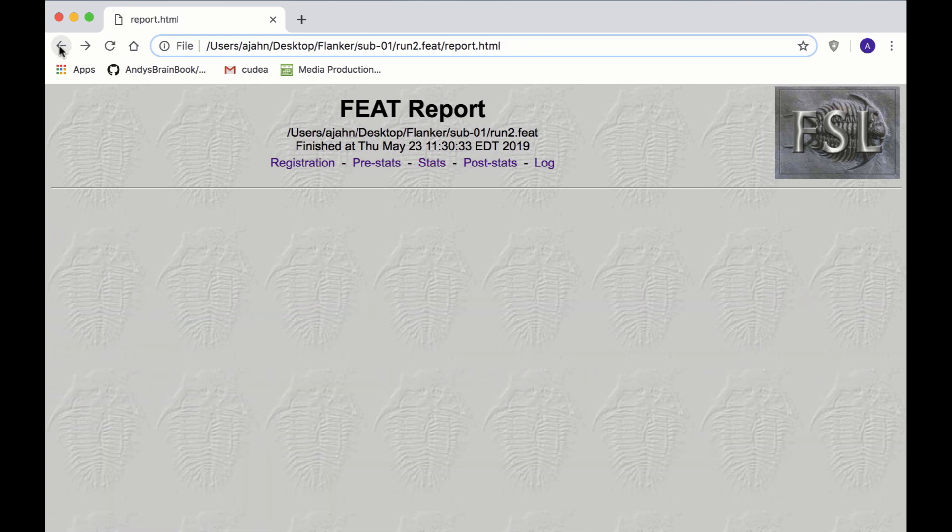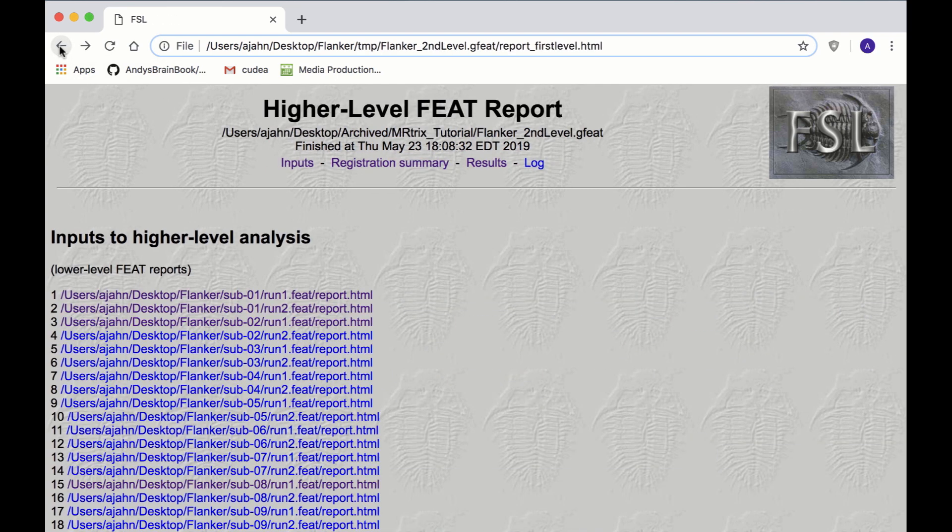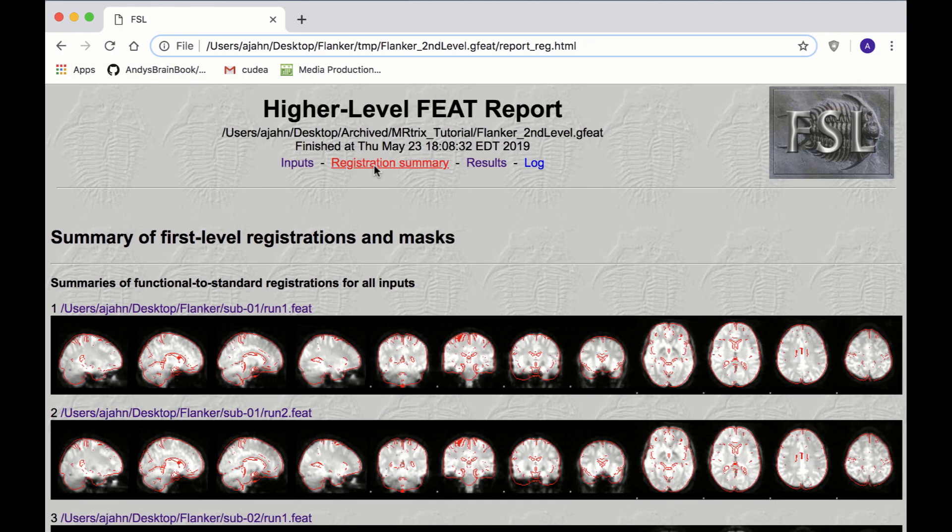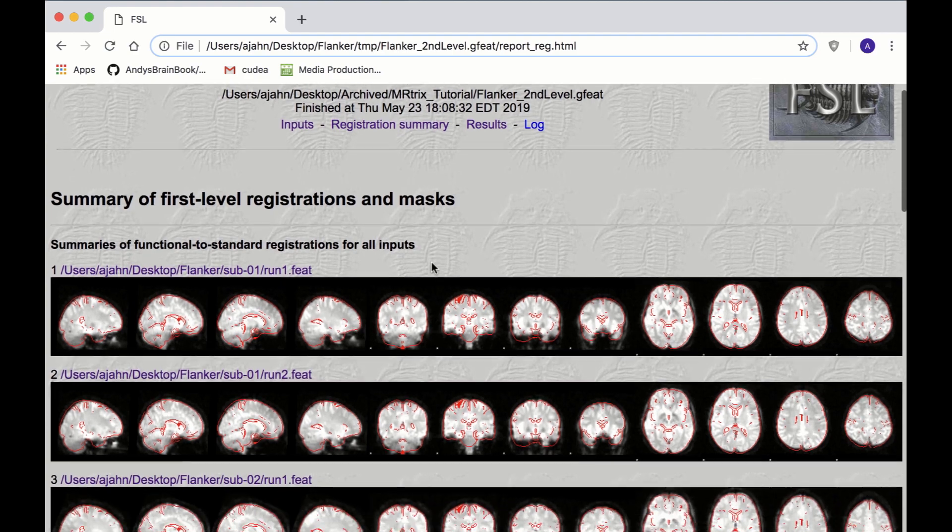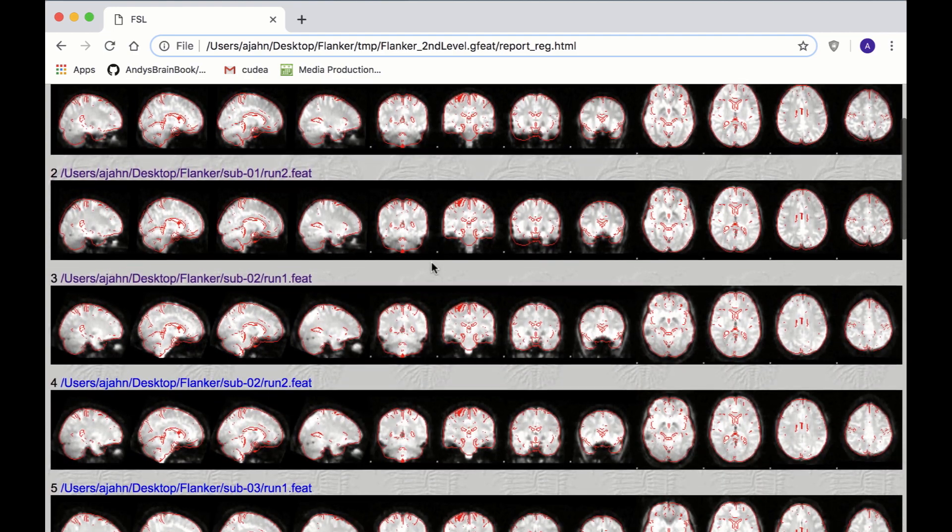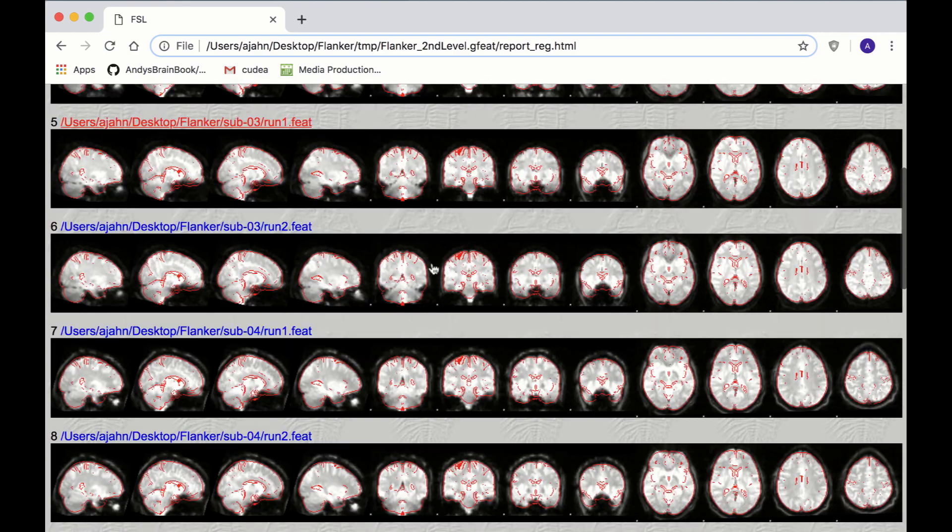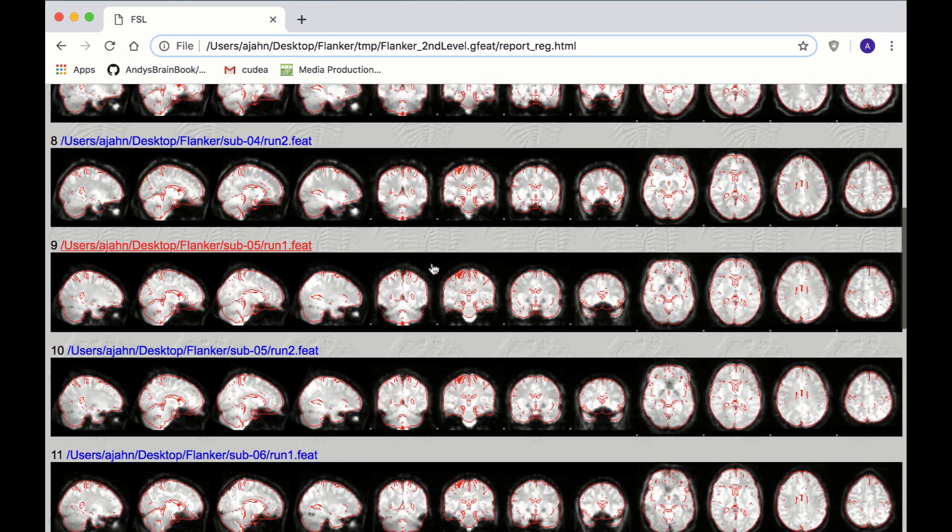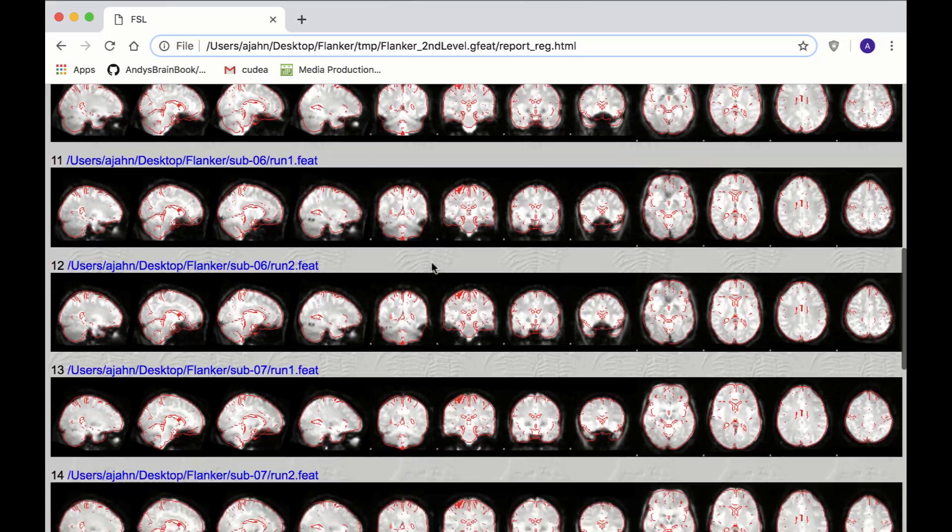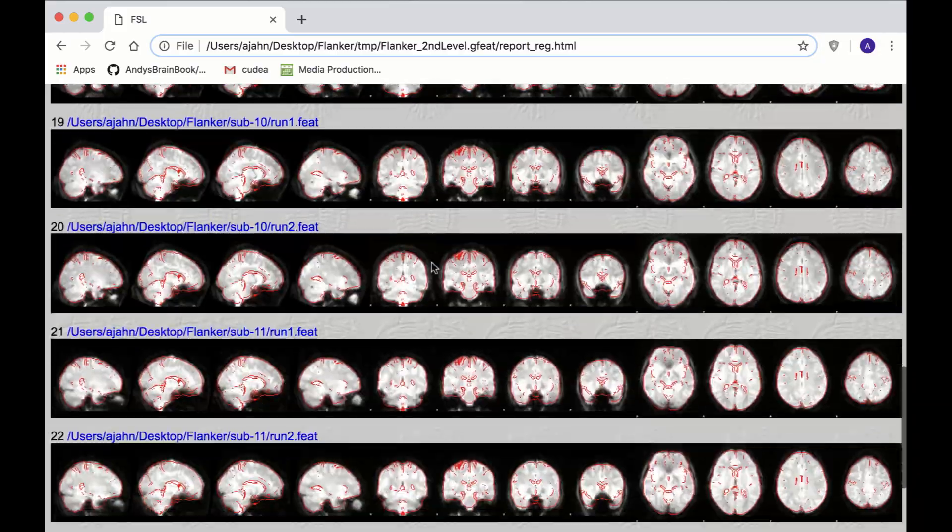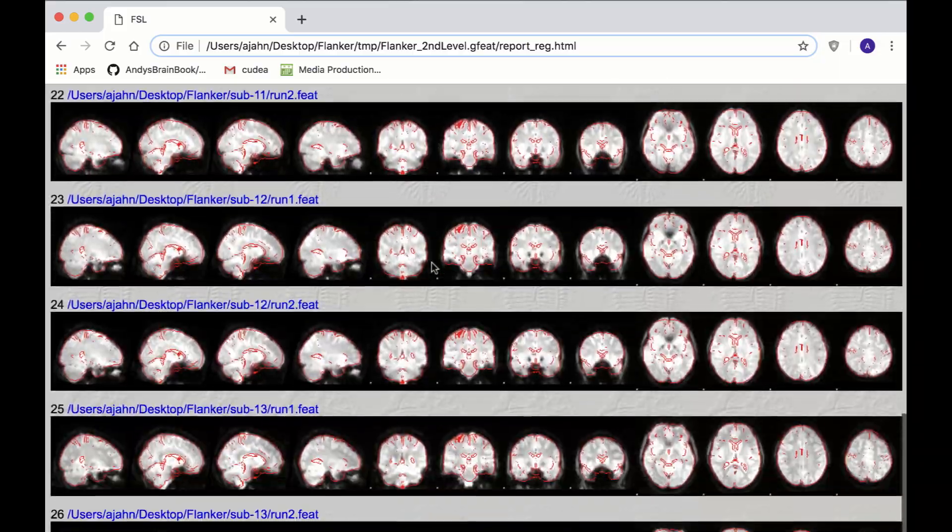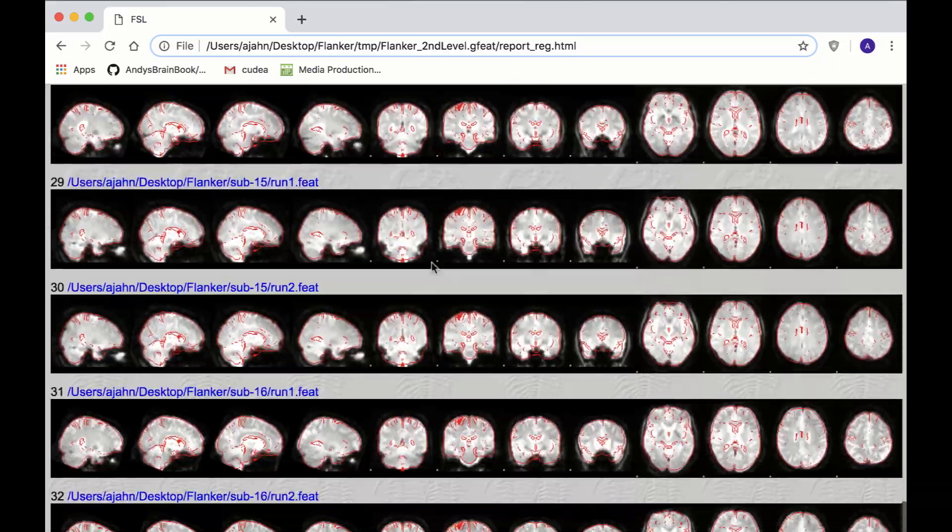And also, the Registration Summary tab shows how the functional data has been normalized to a template. If you checked the normalization during preprocessing, there shouldn't be any problems here, but take a quick look anyway, making sure the red lines trace the outline of the brain.